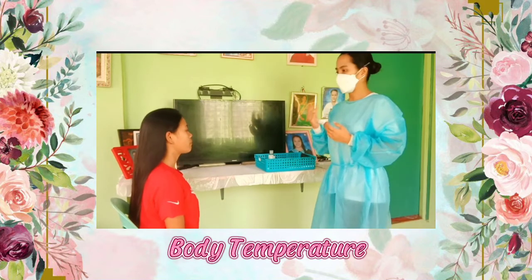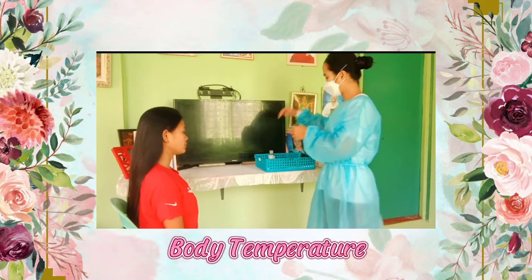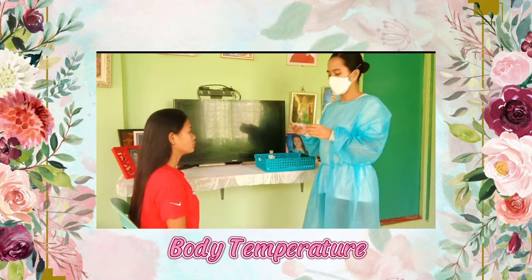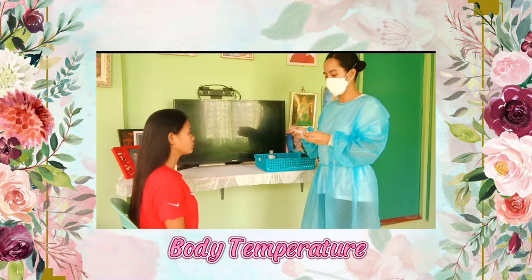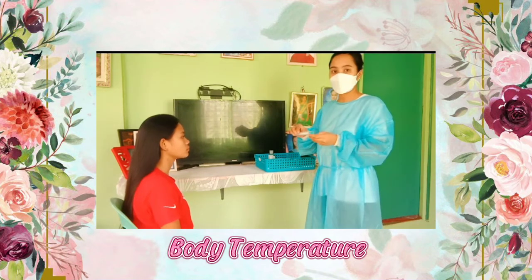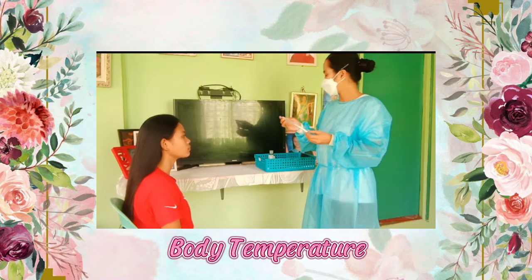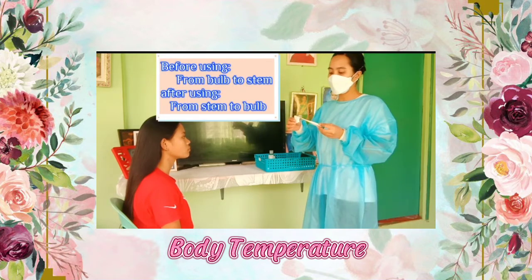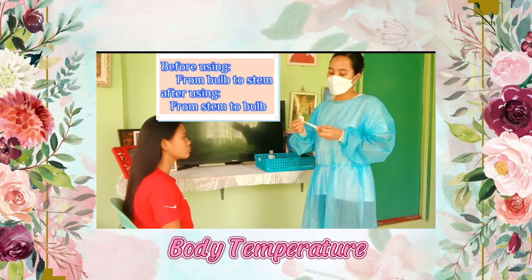Now, I will be assessing your body temperature using this digital thermometer on your axillary site. First, I need to disinfect this thermometer before using it. We're now going to prepare this thermometer by taking it out of its case. Before using the thermometer, disinfect it from the bulb to the stem.